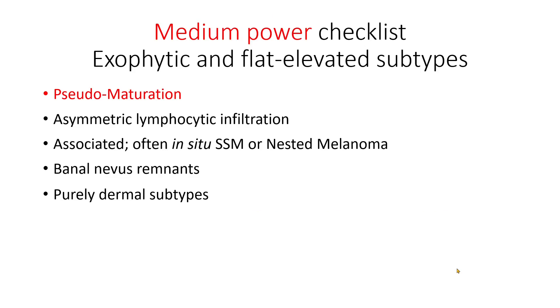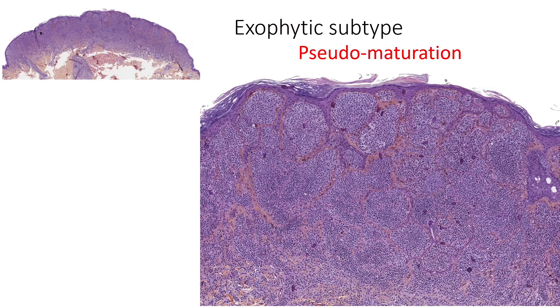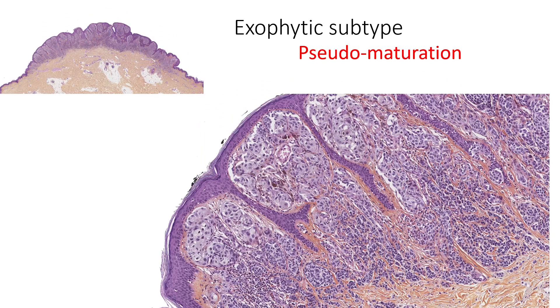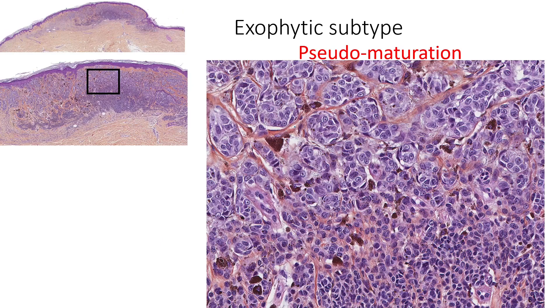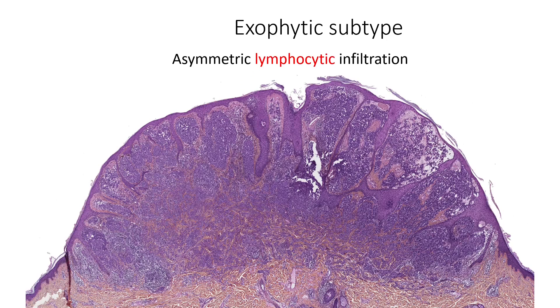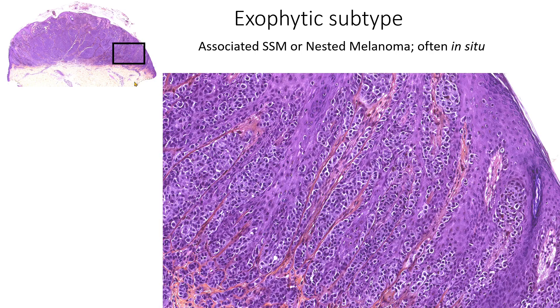Now moving to the medium power checklist, which is common for both exophytic and flat elevated subtypes. Most important is pseudomaturation, meaning there is a diminution in size of cells and nests from top to bottom, which resembles what we can see in most nevi. Some lesions are purely dermal and can have focal lymphocytic infiltration. We can find an association with superficial spreading melanoma or in situ nested melanoma, often on one side of the tumor.